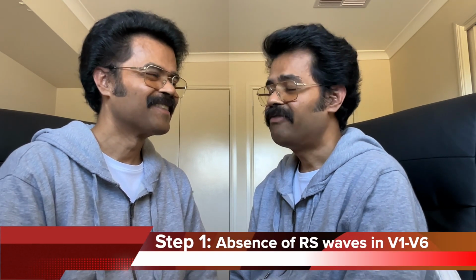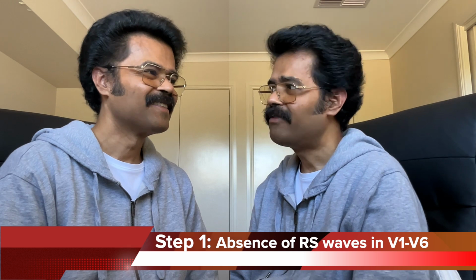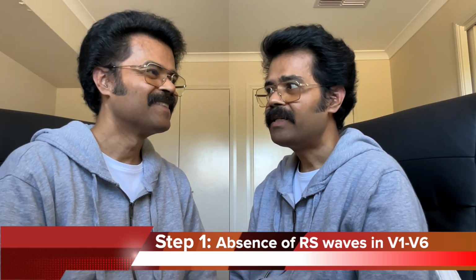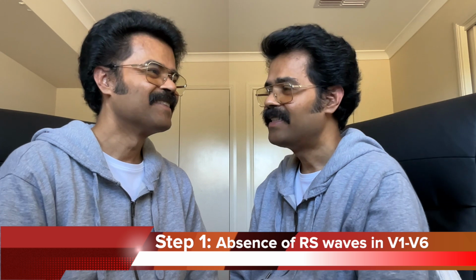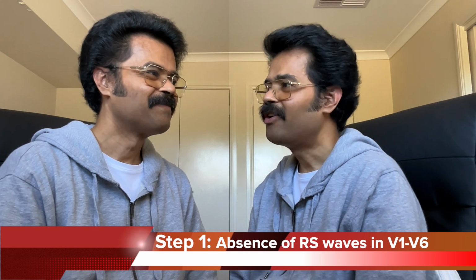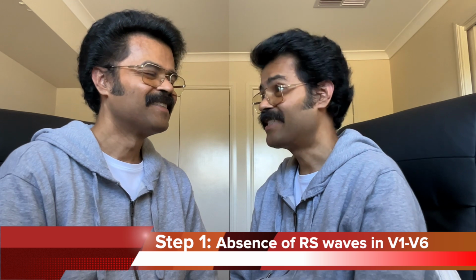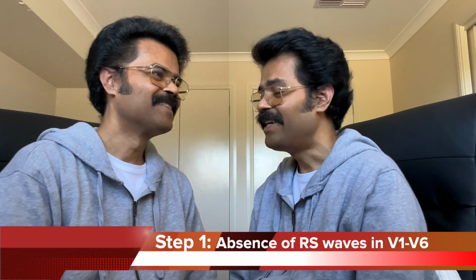This is a stepwise pattern. The first step is something called the RS wave. First of all, you look at the leads V1 to V6. If the RS wave is absent, in other words, if there is concordance of the QRS complex, the specificity for VT is 100%. So it's very likely to be VT.